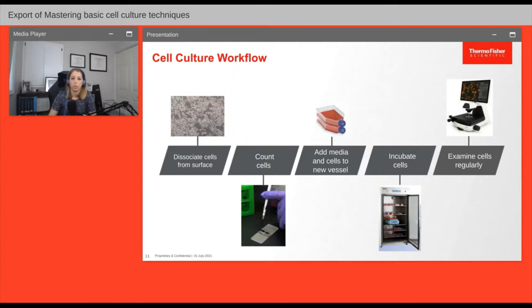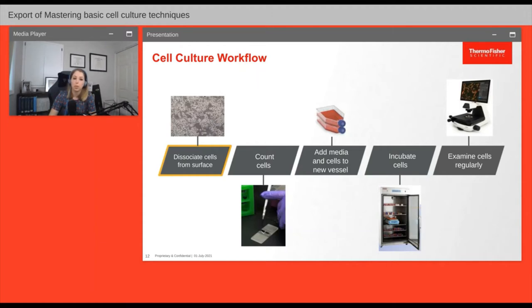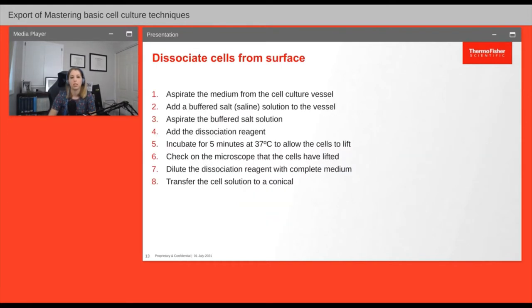Let's go through an example cell culture workflow: subculturing or passaging adherent cells. The first step is dissociating adherent cells from the growth surface. In most cases your cells will be firmly attached to the plastic of the culture vessel, so you add a reagent to get them to release and float in solution. A typical dissociation protocol: first aspirate the cell culture medium, then add a saline solution to wash the cell monolayer and remove residual medium, then remove the saline and add the dissociation reagent and incubate so cells lift off the plastic.